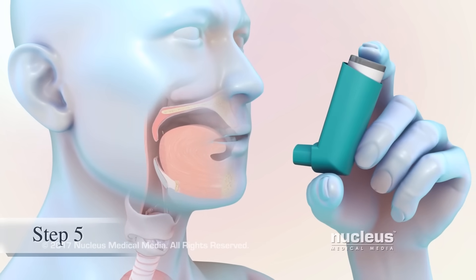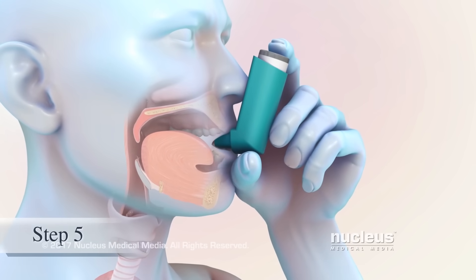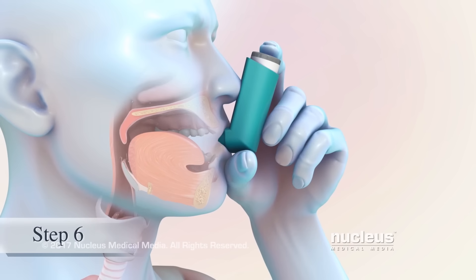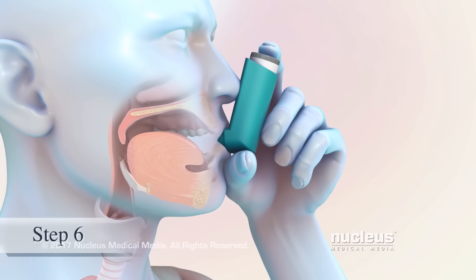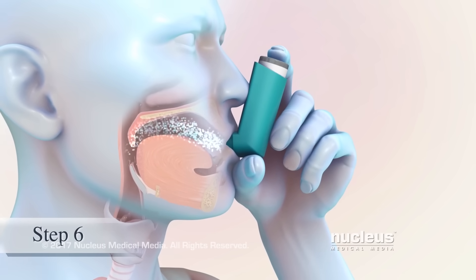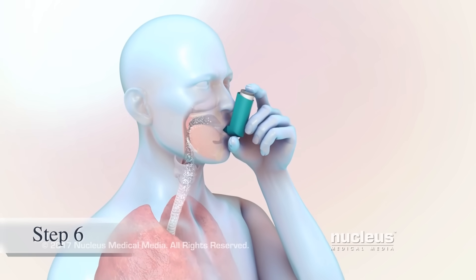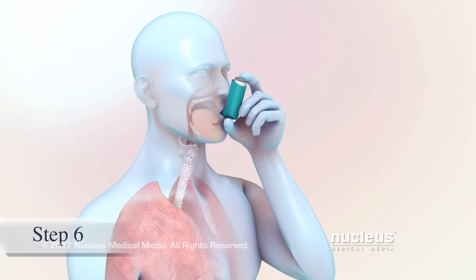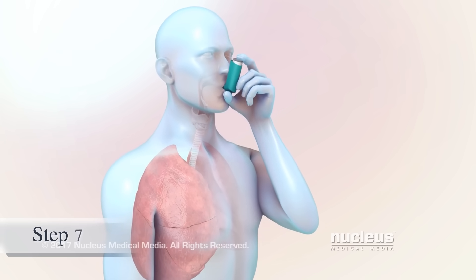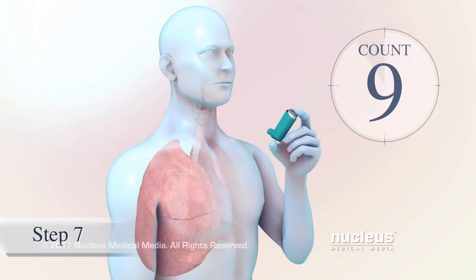After shaking the inhaler, put the mouthpiece in your mouth and close your lips around it to form a tight seal. As you breathe in through your mouth, press down firmly on the top of your inhaler to release one puff of medicine. Keep breathing in slowly through your mouth for three to five seconds until your lungs are completely full. It is recommended to hold your breath for approximately ten counts.